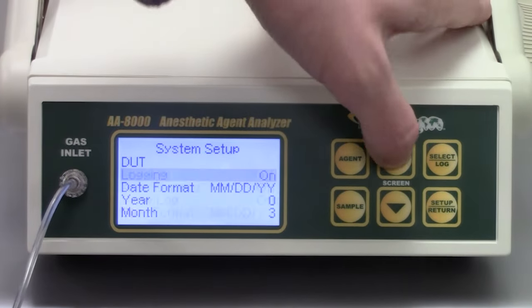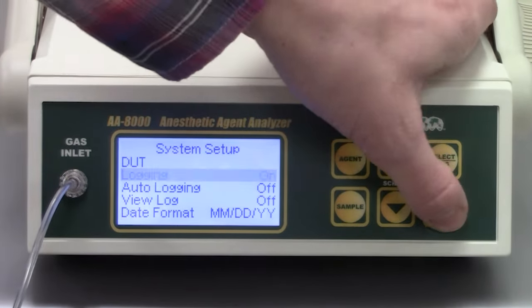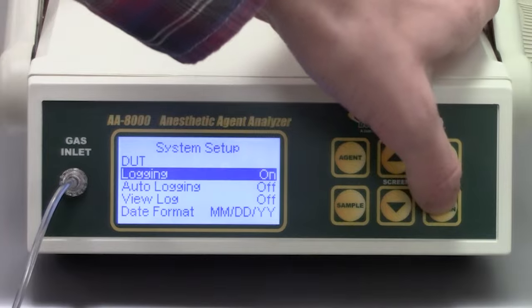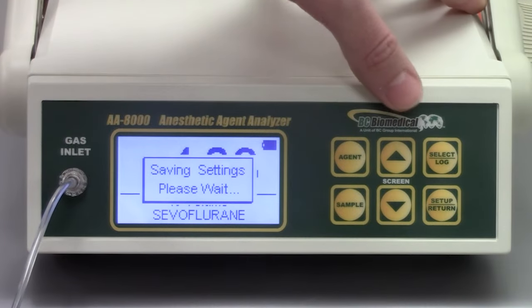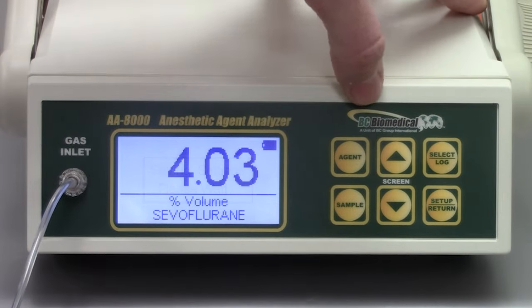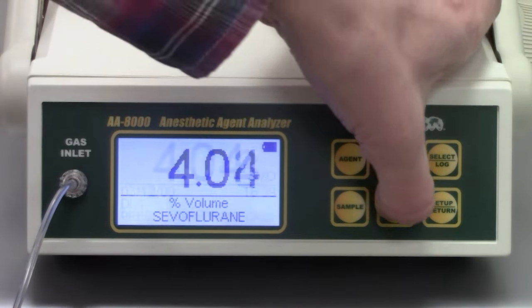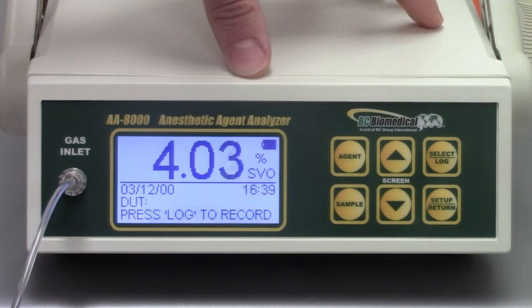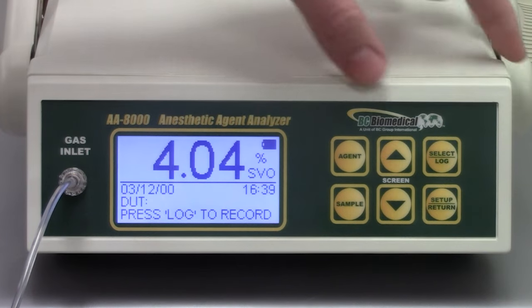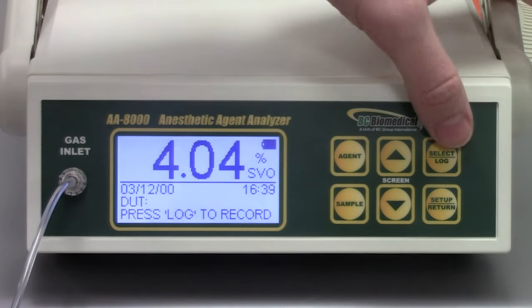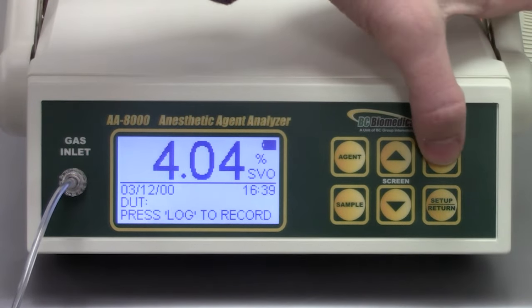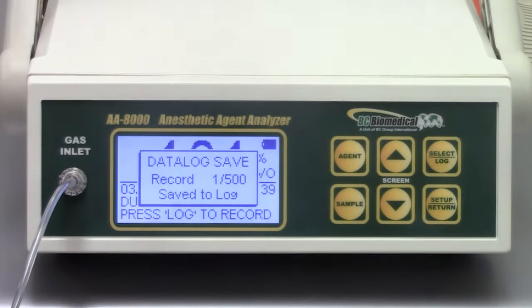The AA-8000 offers a variety of system settings including the option of data logging. It also features auto compensation for temperature and barometric pressure.